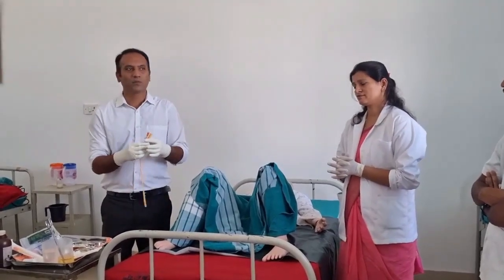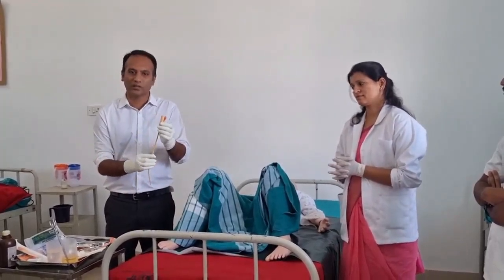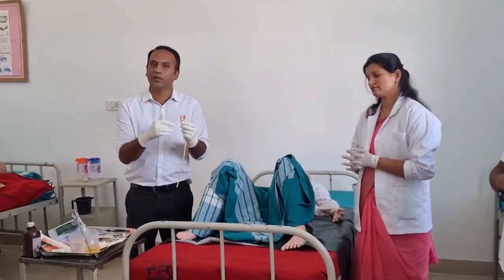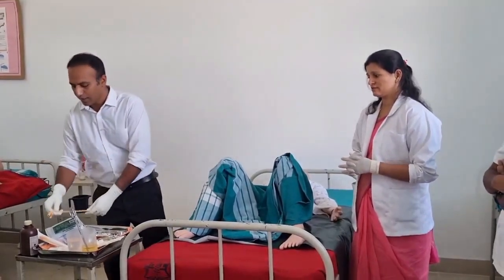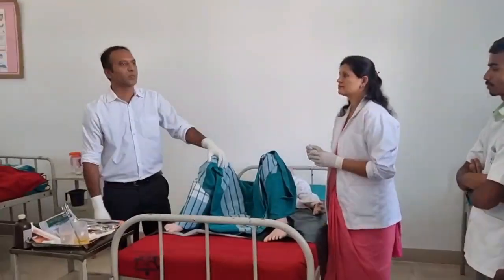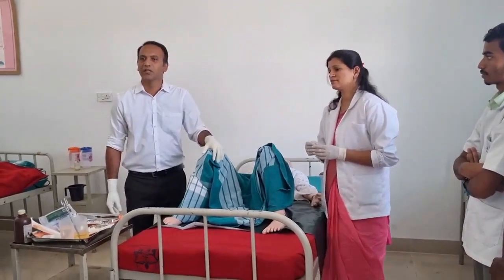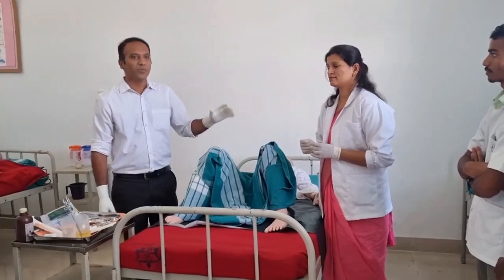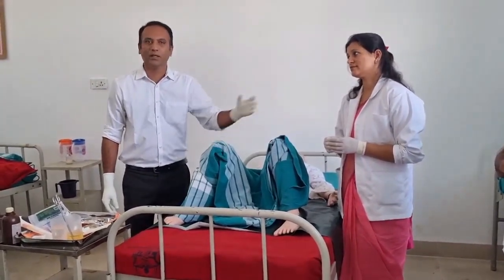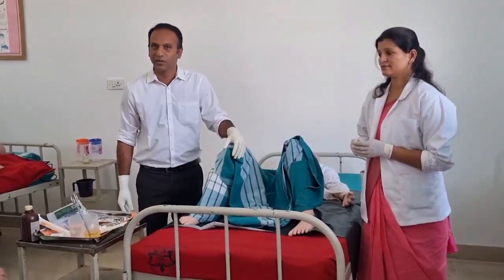For now, this is a dual lumen catheter. There is also a three-channel, or three-lumen, catheter, where the additional channel is used for bladder irrigation or bladder washing. You can see madam is standing beside me because the protocol says that whenever a male healthcare worker, doctor or nurse is performing any procedure on a female patient, a female attendant, healthcare worker or nurse should accompany. That's the reason madam is standing here for assistance.